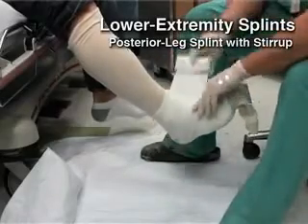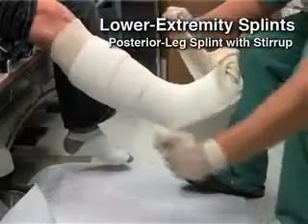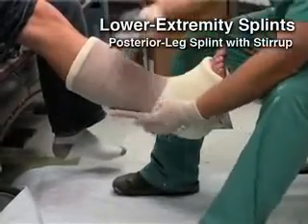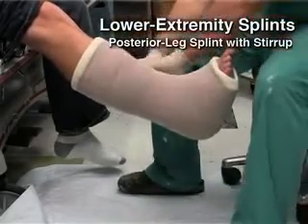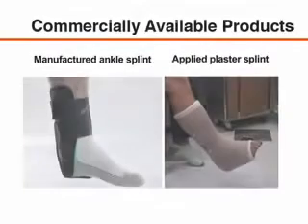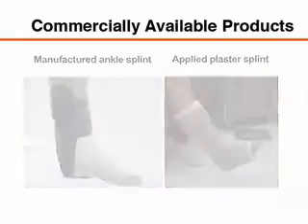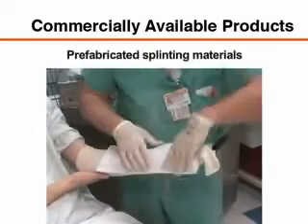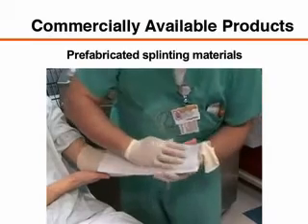Adding a lateral stirrup component to a posterior leg splint increases splint stability and prevents inversion or eversion of the ankle, providing greater immobilization and stability for fractures near the ankle. Apply the stirrup splint to the medial and lateral leg extending from the tibial tuberosity, wrapping around the foot and ending just below the fibular head. Mold the splint with the ankle at a 90-degree angle. Commercially available ankle splints may be used to enhance comfort after a sprain but typically do not provide the necessary stability for fractures. Similar products are available for upper extremity sprains, such as a soft wrist splint. Prefabricated splinting materials can also be used to create a wide variety of splints using modifications of the techniques demonstrated in this video.